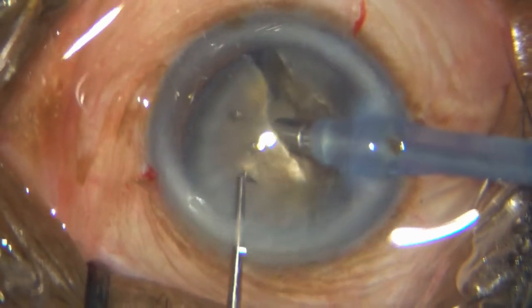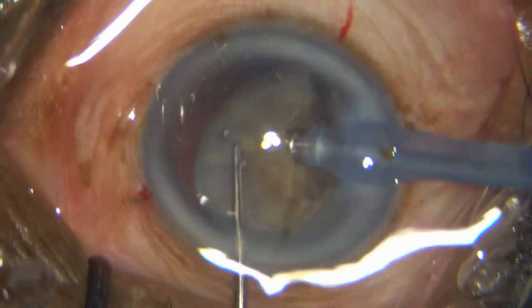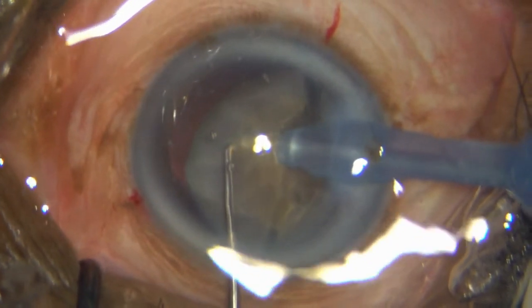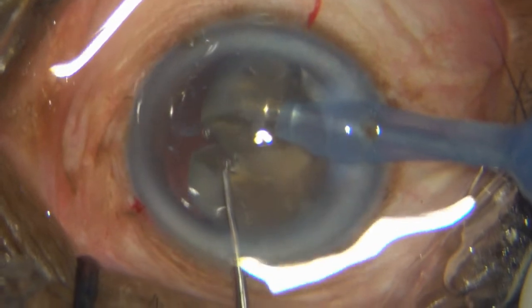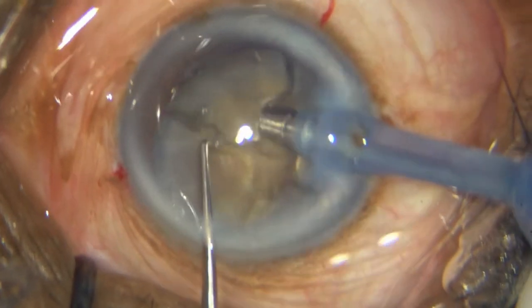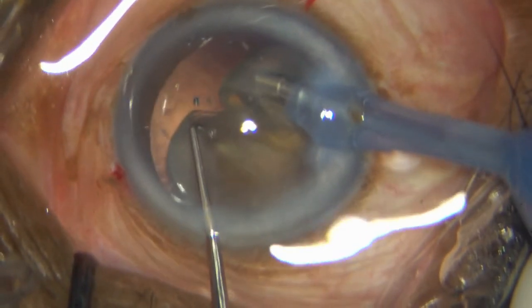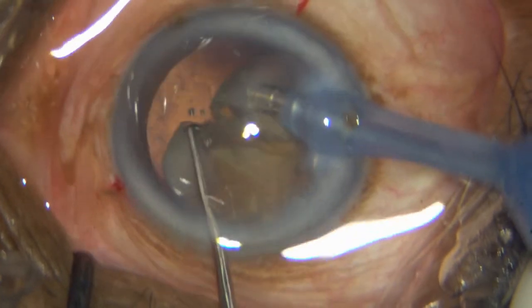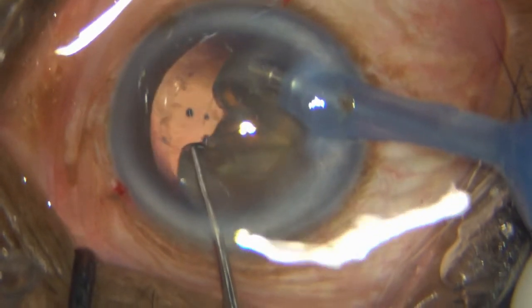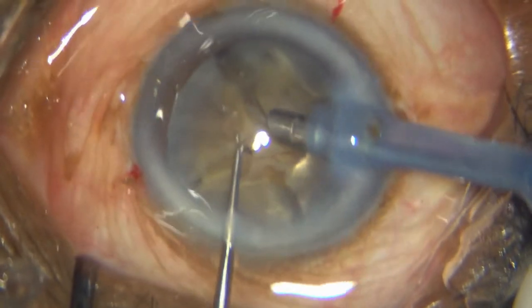You can see it is a little difficult to control the mobility of this mobile nucleus, but pretty much in control, if I must say so. So I just hold that piece since it didn't separate well and try to do a multi-level separation. I am targeting these pieces to make them smaller.